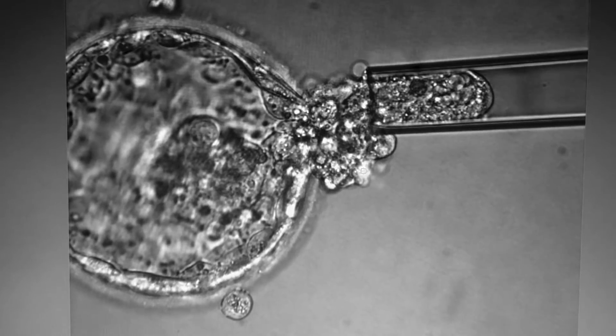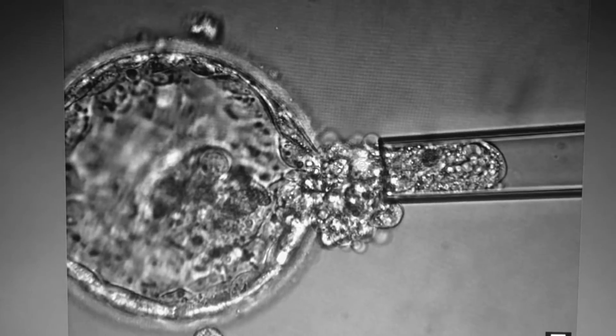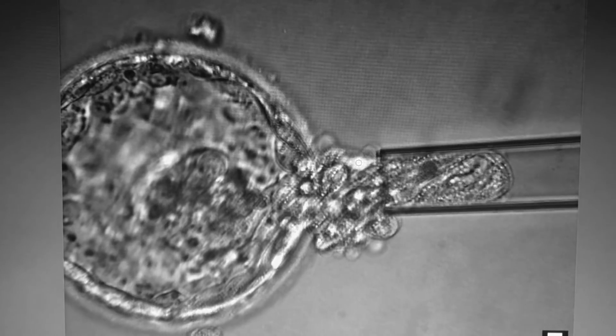One must be exceedingly careful while performing this entire procedure because it runs a high risk of causing permanent and severe embryo damage if the procedure is not being performed correctly.